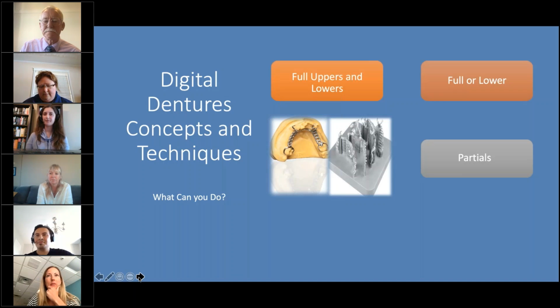As Steph pointed out to me one day, I was messaging with her because it's always hard to find a lab that can produce dainty clasp assemblies and finer major connectors. Steph's point was that when you're having titanium frames milled, if you're having a repair done, then a cast clasp is not necessarily going to bond with that titanium frame. Those are some of the things we've been learning as the months have been rolling on, but we love the milled titanium frames.